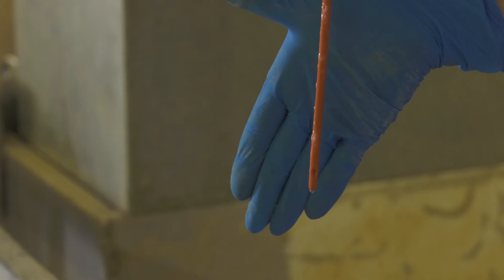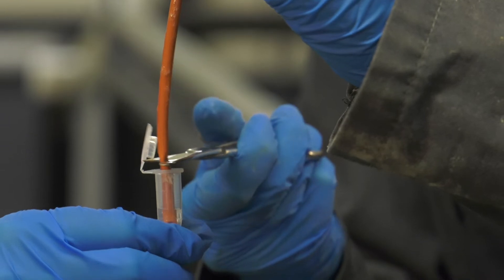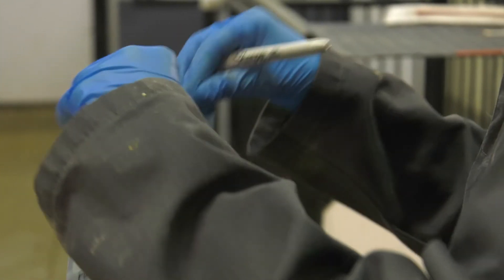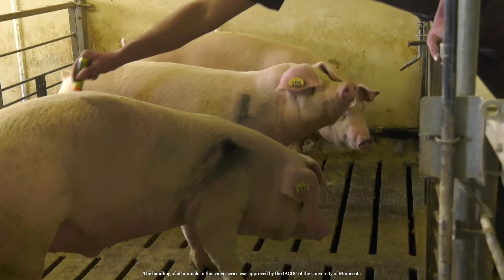When you clear the larynx, collect the sample by rotating and sliding the catheter up and down and around the trachea. When you remove the catheter, check to make sure there's enough mucus on the catheter for a good sample. Cut the mucus end off the catheter, then place it in a sterile tube. Close and label it before placing it in a labeled bag. Fill out the submission form for that pig sample, then mark the pig as sampled.